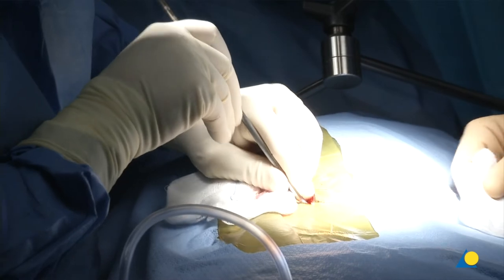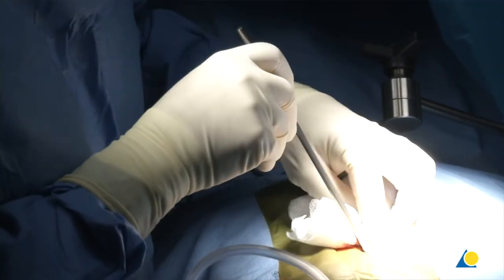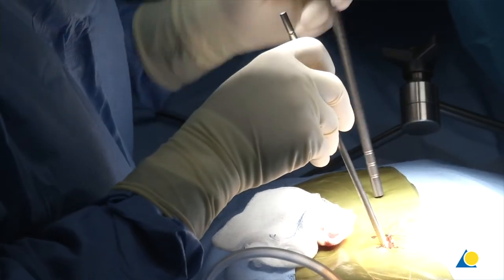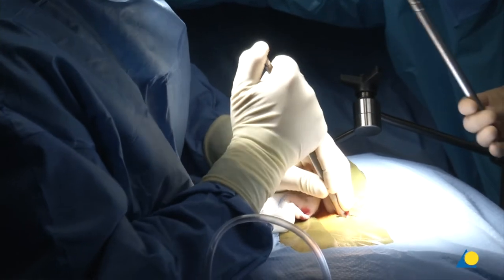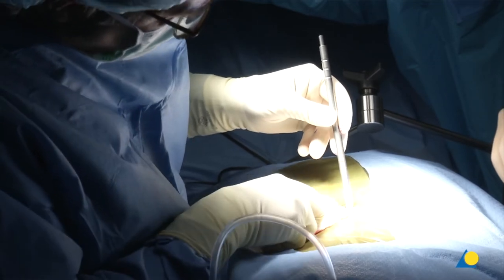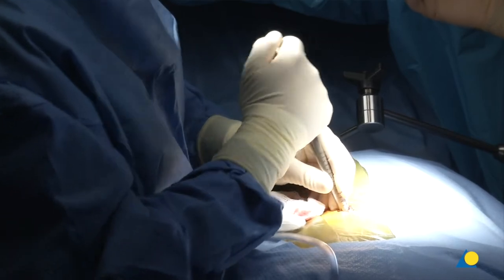I feel for the L4 lamina right here and I want to dock at the inferior edge of the L4 lamina — right at the top of the triangle on the x-ray. I use the second dilator, keeping my thumb on top of the first so it doesn't come out. I can already measure the depth of the retractor — about 40 to 50 millimeters — so I'll pick a 50. We'll need an 18 by 50 tube. Let's put the retractor in.